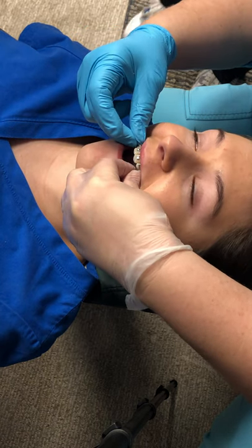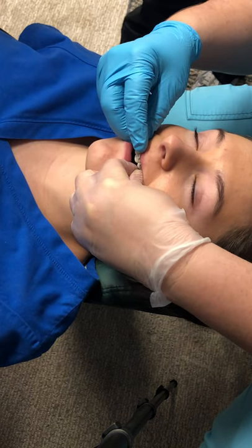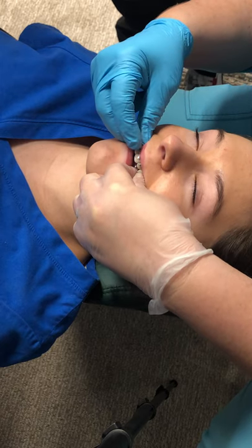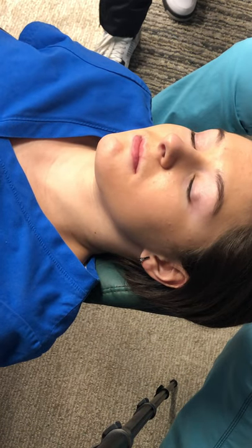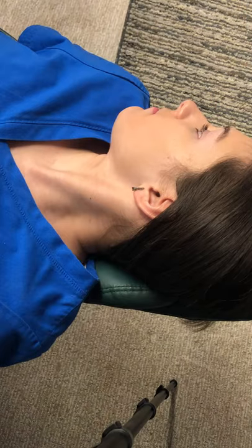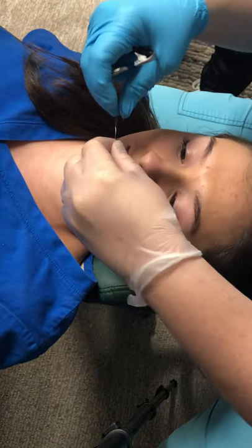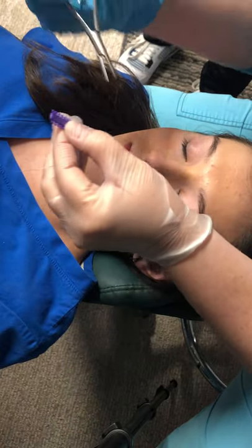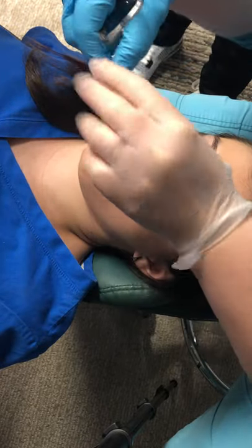Open a little bit. There's a little dimple there, and that dimple — or sometimes it's a little identification dot — tells you to put it right between the centrals where the midline is. I'm going to grab some pretty colors for her. I'm going to grab one of my Power O's, or elastic ties. The dimple points up — open, sweetie. I'm going to put that in the center and make sure it gets in the slot.